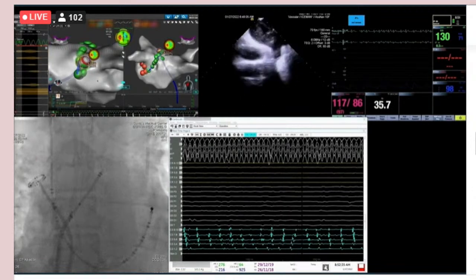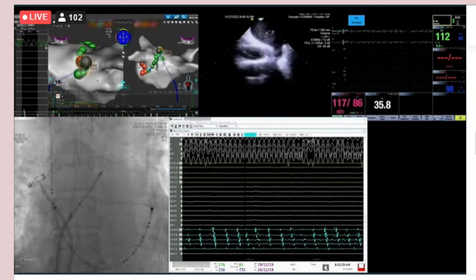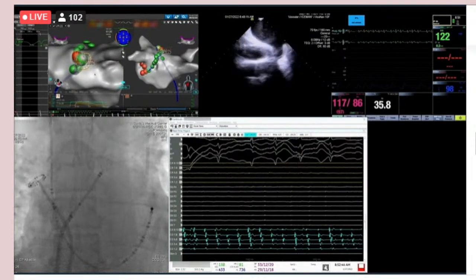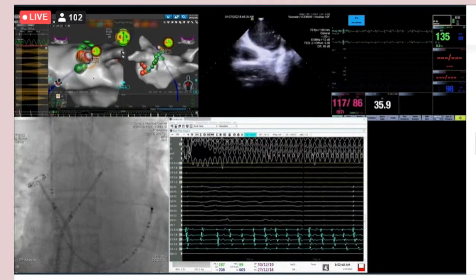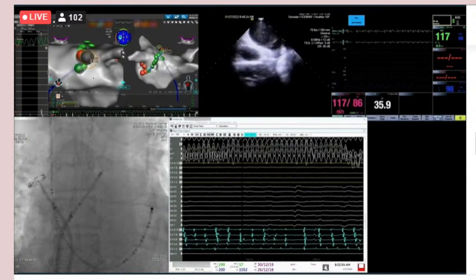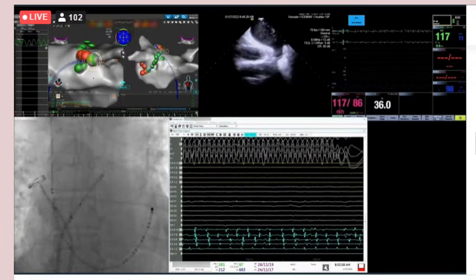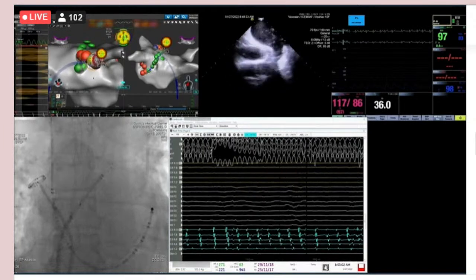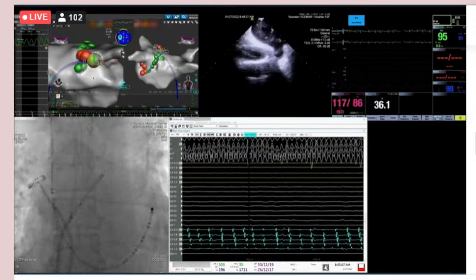Now here we're moving to the opposite side, so we skip forward, moving to the anterior side, and you see we're using RF in these locations, particularly on the border of the appendage and left superior. We switched to RF, and once again, it's going very quickly. Did not see any heating on the posterior wall. We did use a temperature sensor in the esophagus, so no heating on the posterior wall using electroporation.